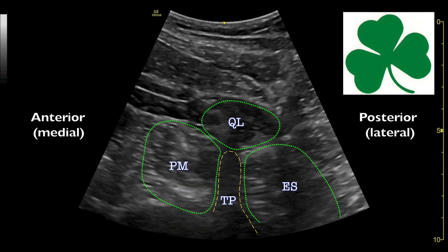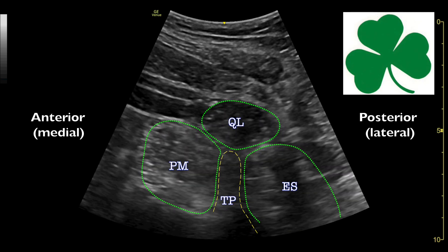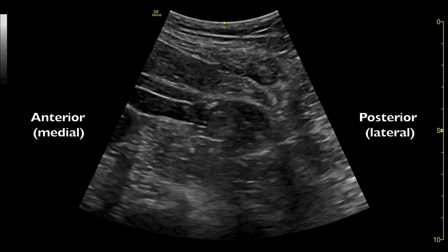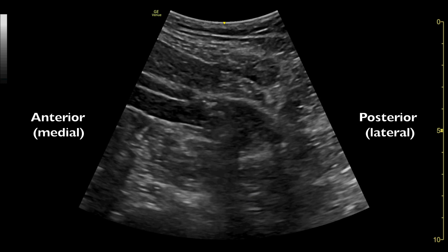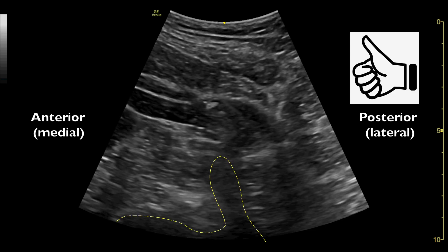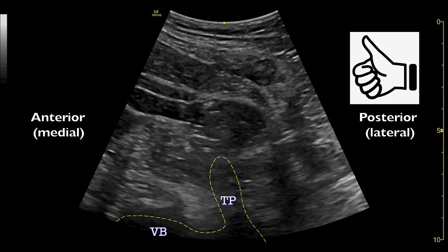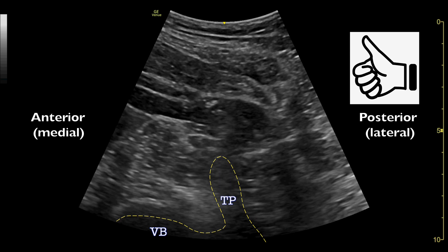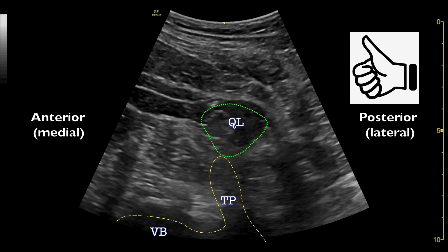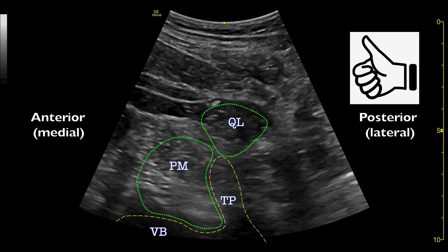Note that the quadratus lumborum is usually more hypoechoic in comparison to the other two muscles. Another method to identify the relationship of the relevant sonoanatomy structures is to look for the thumbs up sign. The transverse process is the thumb, with the vertebral body as the knuckles. The thumb points to the quadratus lumborum. The structure at the knuckle side, which is anterior, is the psoas, and the structure behind the thumb is the erector spinae muscle.